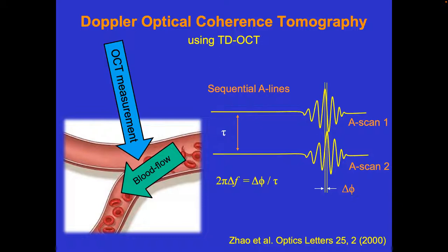Right, but if we're measuring at a perpendicular angle, then it would go from like this to this. So what's your beam? Your beam starts from the top, okay? And how's your particle moving? Perpendicular. So the point is then that there is no change. Exactly, so then you won't measure a shift. Yes, right. I was confused because in the picture, I thought, wait, they're moving perpendicular to each other. Or, not quite perpendicular, fair enough. But it is correct that if they are perfectly perpendicular, there's no Doppler shift.